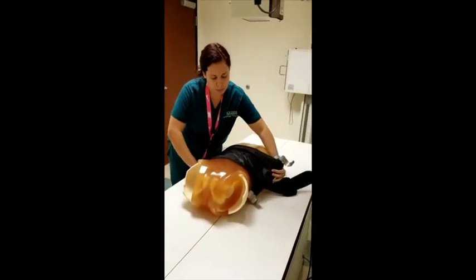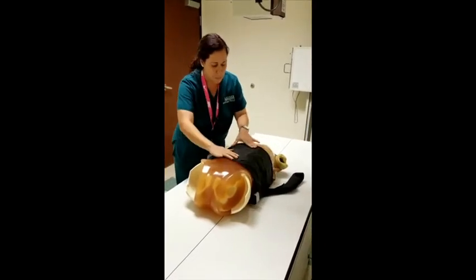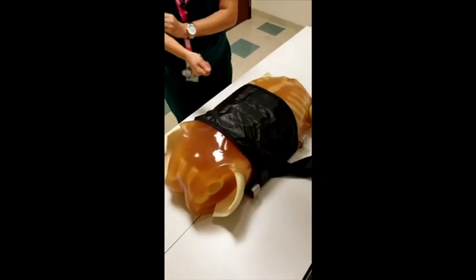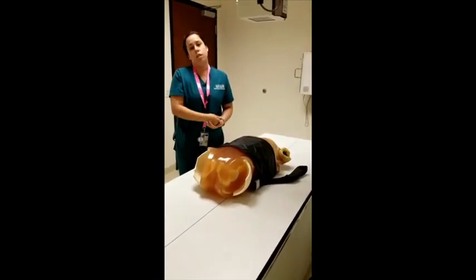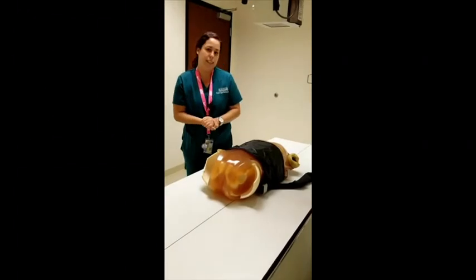When we press it up against the patient, we're reducing the tissue thickness, the patient thickness. Therefore, we reduce scatter from reaching the image receptor. So more X-rays are actually penetrating into the image receptor, producing a higher contrast image.